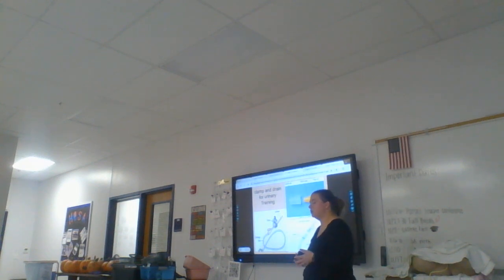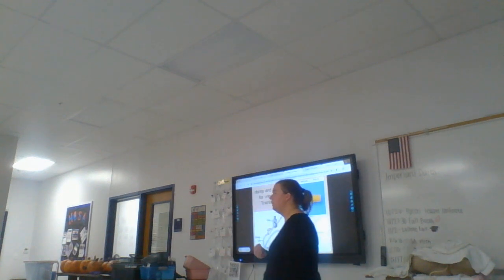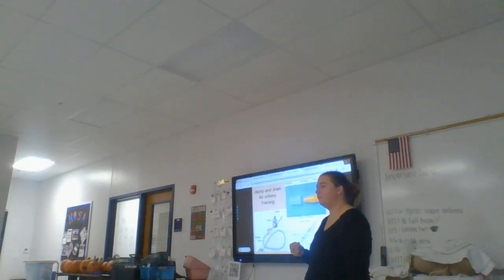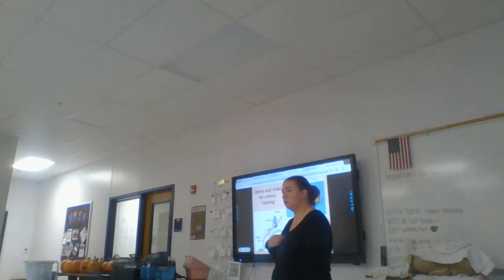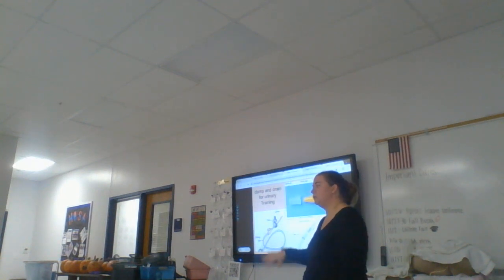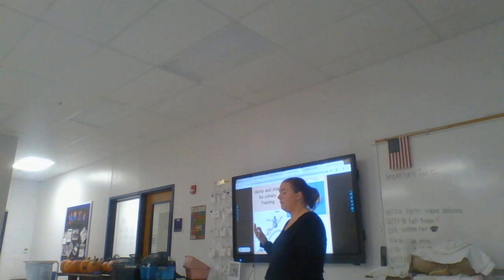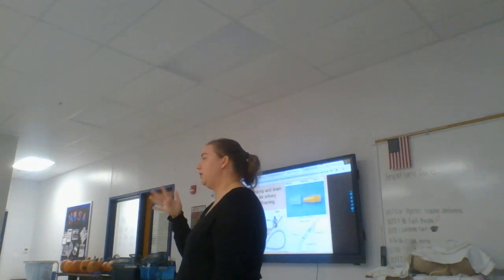One of the things that we talked about last week was bladder training. Bladder training is when we clamp the catheter off for an hour or two. That gives them the sense of urge, oh, my bladder's getting full. Just like you and I, because we're not incontinent, we need to feel that sense of urge to retrain our bladder. Otherwise, when you have a Foley or a catheter, those two words mean the same thing, for a while, your bladder gets lazy.